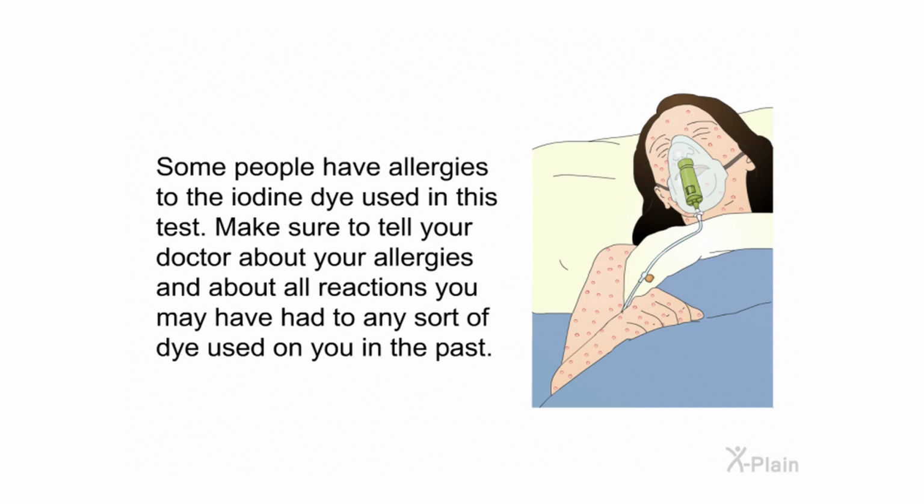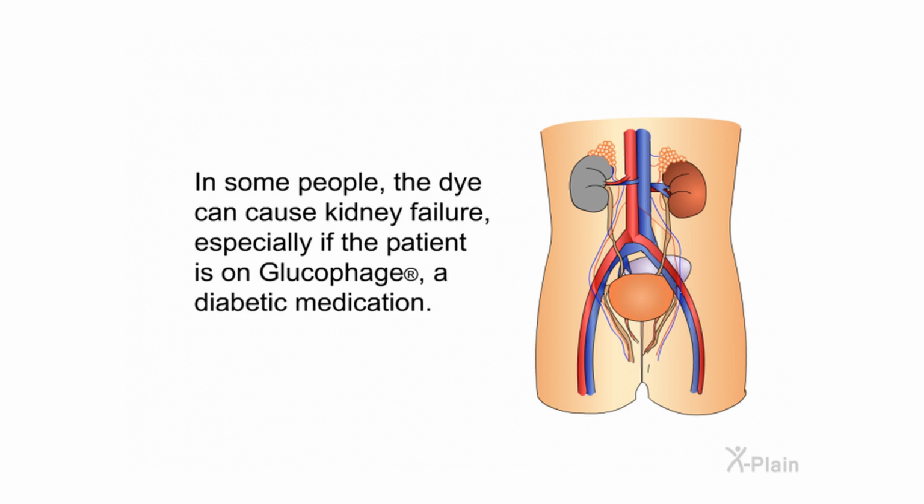Some people have allergies to the iodine dye used in this test. Make sure to tell your doctor about your allergies and about all reactions you may have had to any sort of dye used on you in the past. In some people, the dye can cause kidney failure, especially if the patient is on glucophage, a diabetic medication.